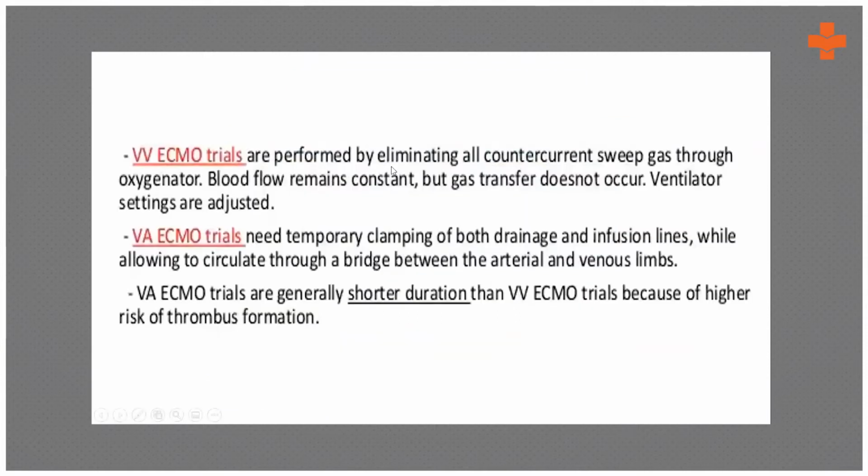So VV-ECMO trials are performed by eliminating all countercurrent sweep gas through the oxygenator, because you have to remember that VV-ECMO was done to basically help you out with your respiratory failures. So once we stop the gas flows, we want to know whether the blood without the gas flow is still maintaining the oxygenation. Now, VA-ECMO is used more in cardiac failures or cardiomyopathies.